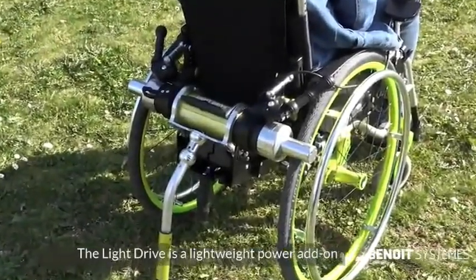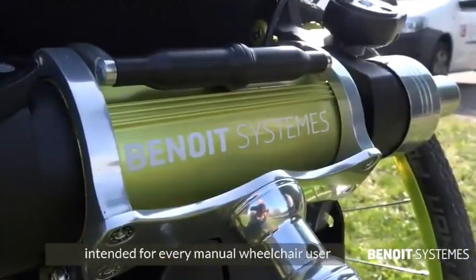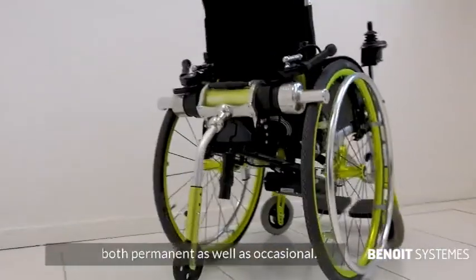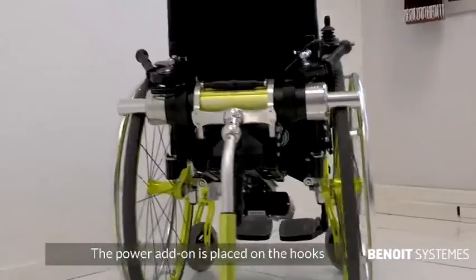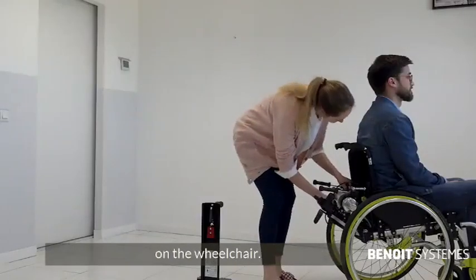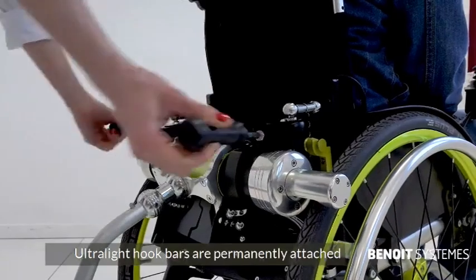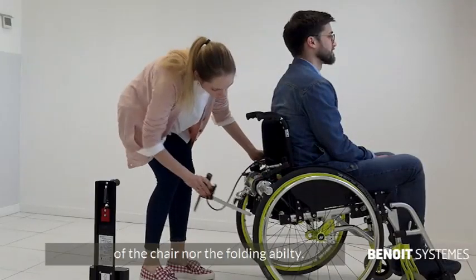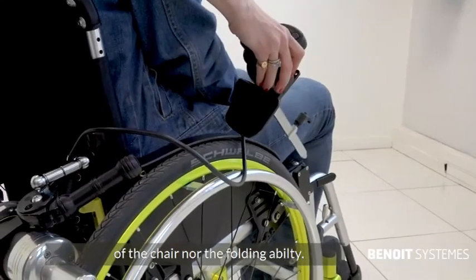LightDrive is a lightweight power add-on intended for every manual wheelchair user, both permanent as well as occasional. The power add-on is placed on the hooks on the wheelchair. Ultralight hook bars are permanently attached to the wheelchair backrest. They won't change either the overall dimensions of the chair nor the folding ability.